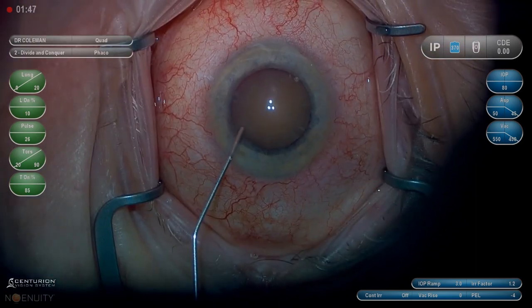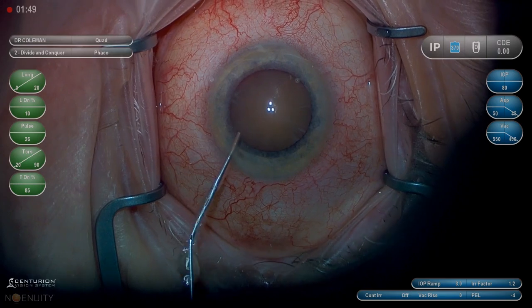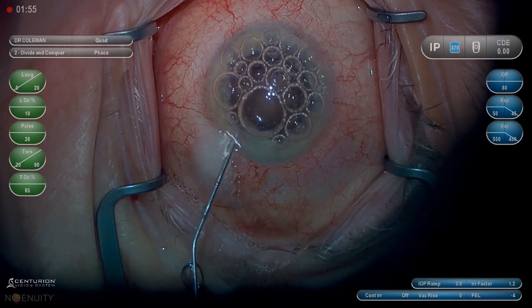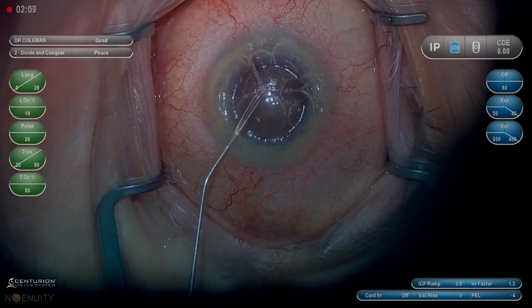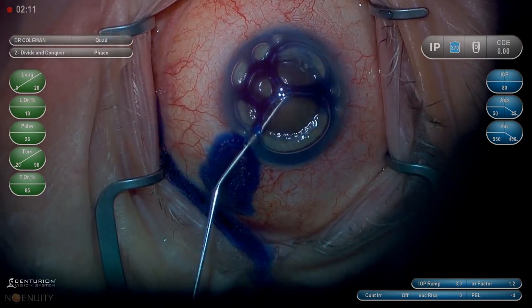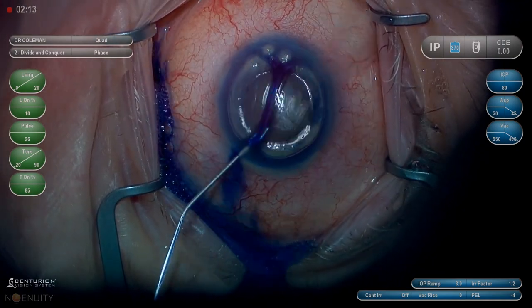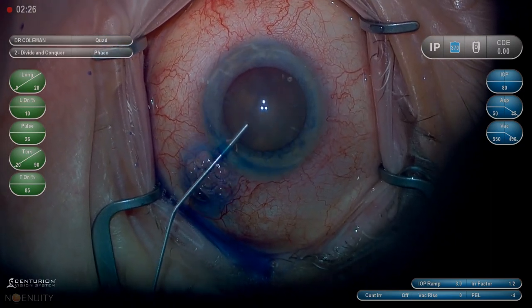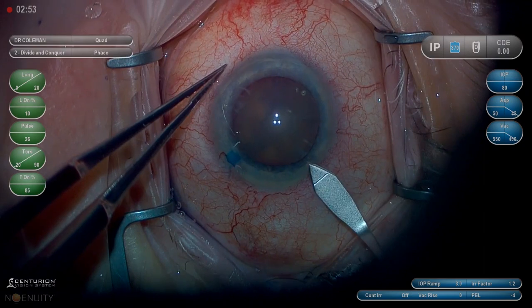We'll make our paracentesis about a half a millimeter anterior to the limbus. We can use the same cannula to draw air and fill the anterior chamber with air prior to using trypan blue to stain the capsule. We'll burp out the viscoelastic and the remaining trypan blue to get a good view.